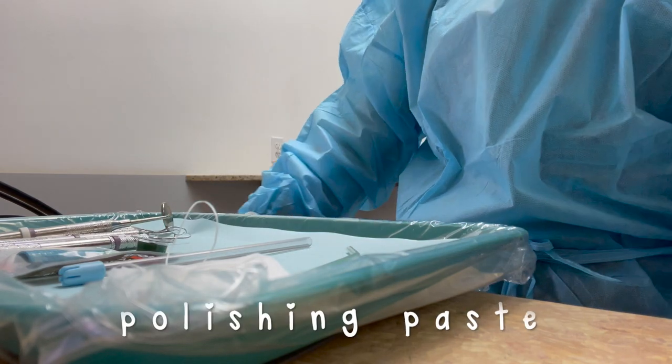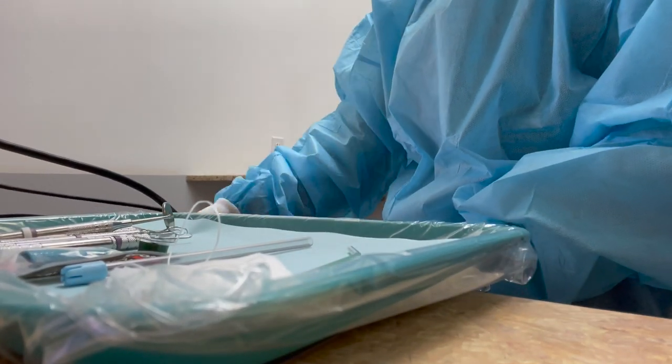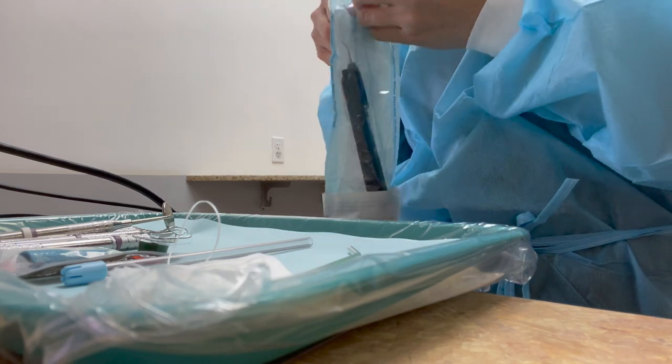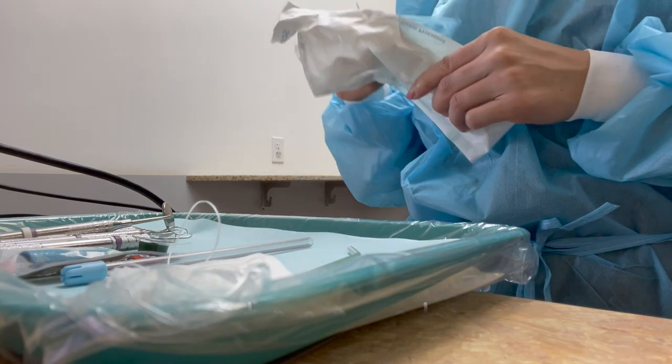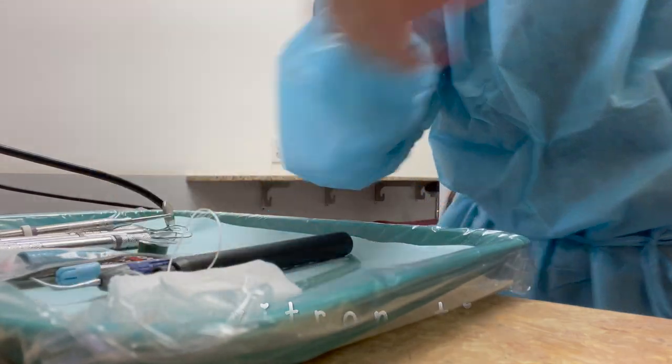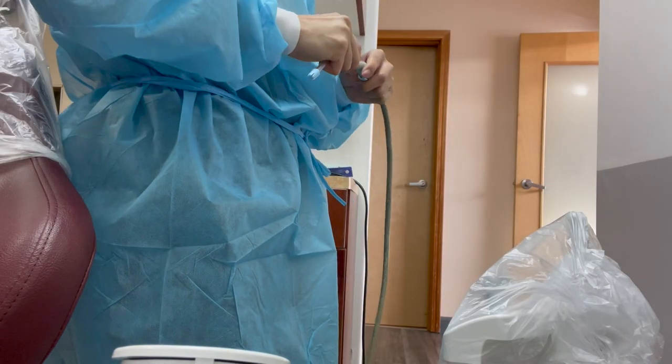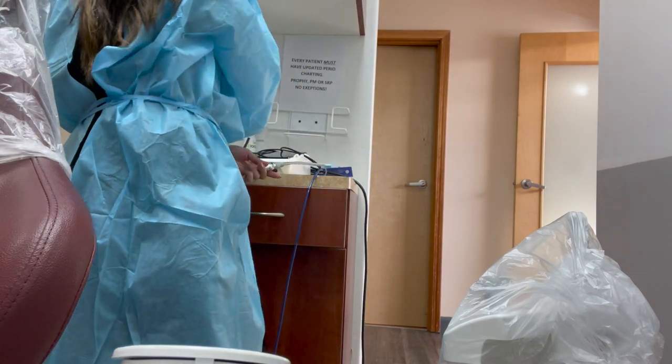Down below is a drawer to keep all of the supplies. That's a prophy angle and some polishing paste. The last thing that I am going to set up for the cleaning tray is the cavitron — so this is a cavitron sleeve and a cavitron tip, and I'm placing it here on the tray.